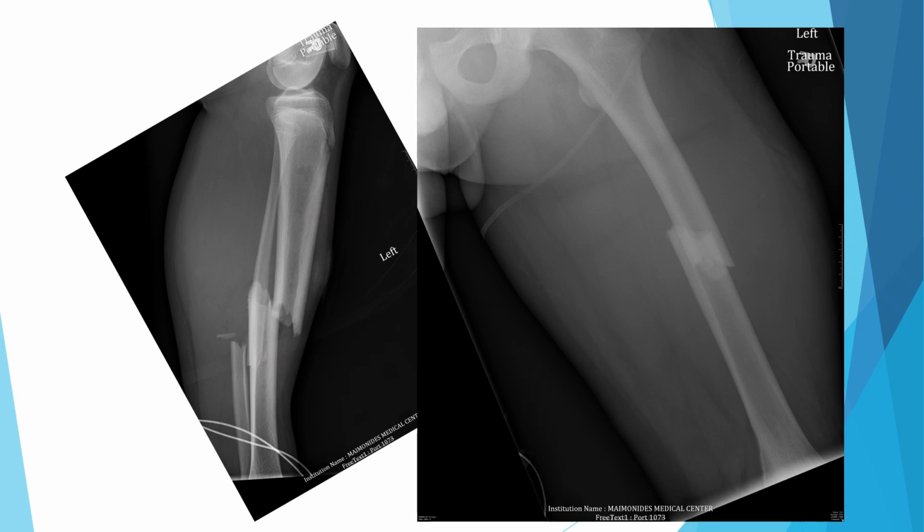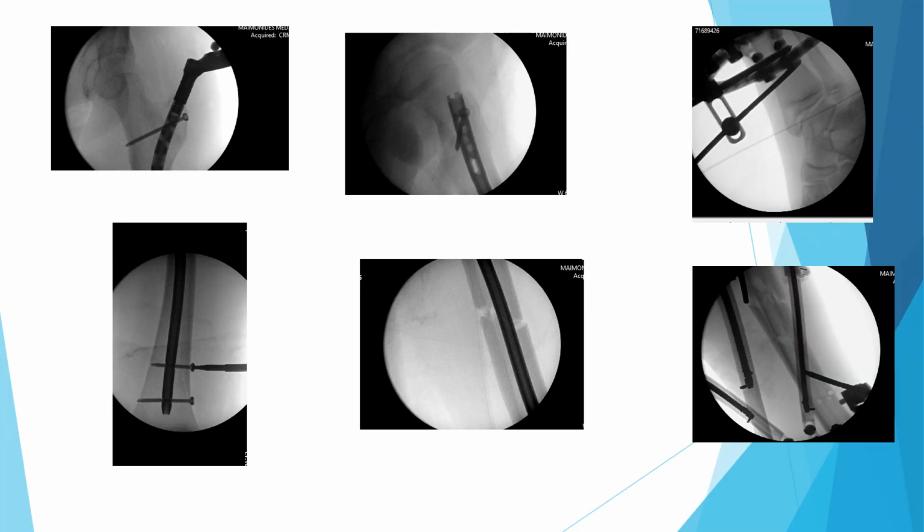This is one of my patients. At that time, he was a 13-year-old polytrauma patient. This is an open 3A left tibia fracture, and ipsilateral he has a femur fracture. We took him urgently to the OR.